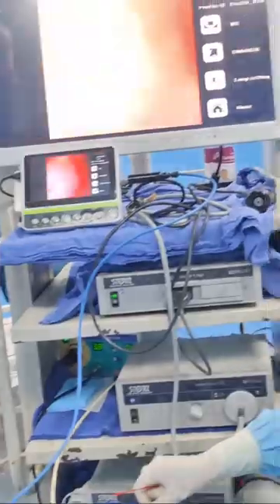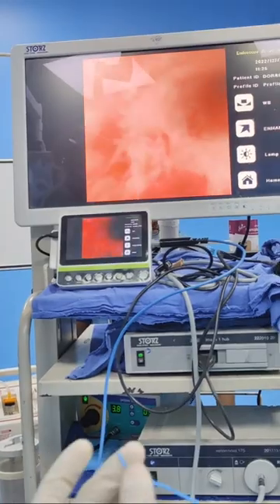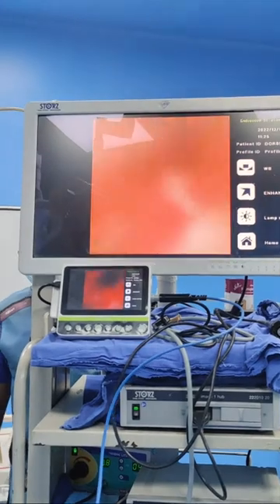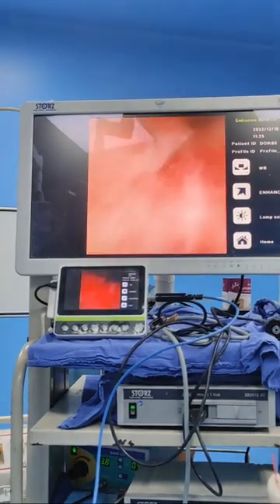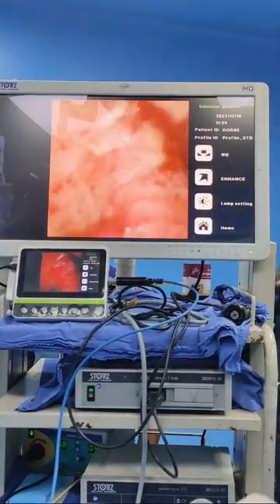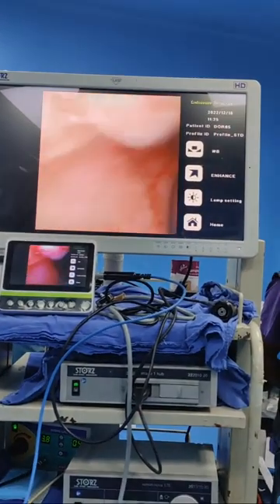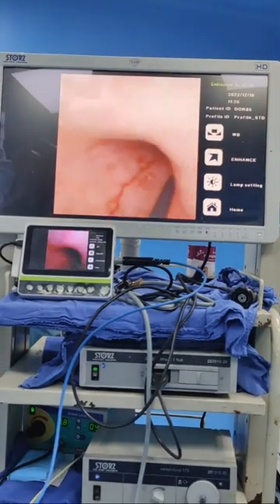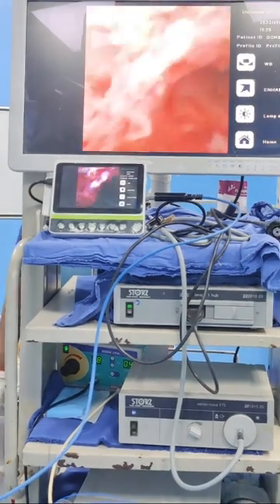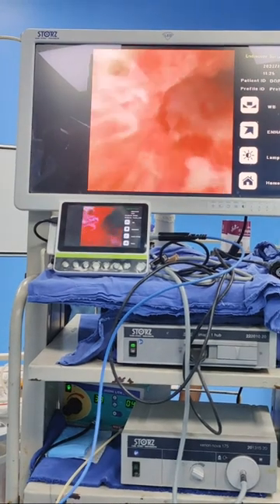So coming to this question, when to put a DJ stent: when you want a stent to heal the ureteric injury, when you suspect that there is an infection and you want very good drainage afterwards, because you cannot keep a nephrostomy for a long time, right? So we will remove those small fragments in the next sitting because we have already passed 1 hour 50 minutes, so we'll put a stent here and put a small nephrostomy tube so that we can come in again after 2 days.